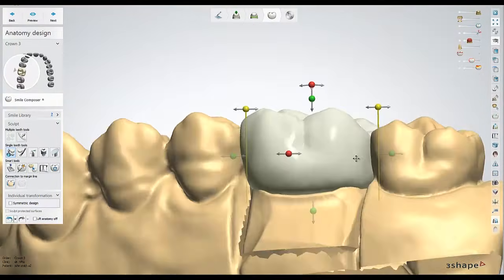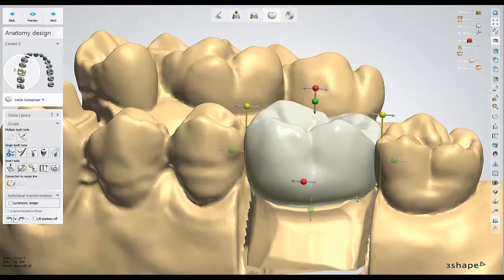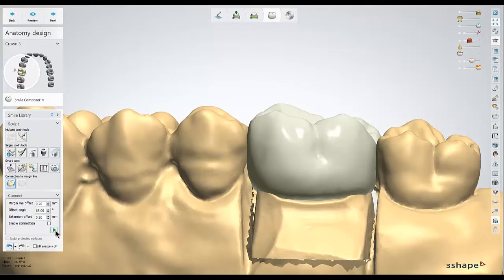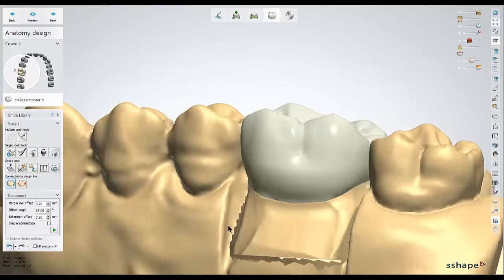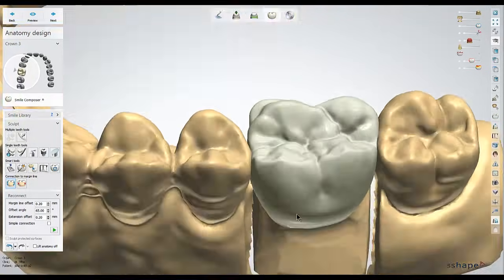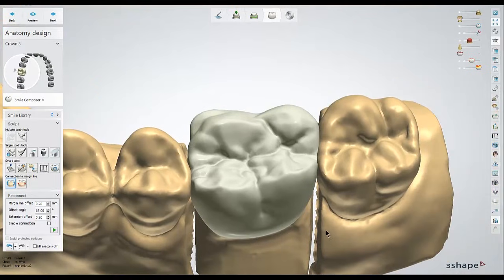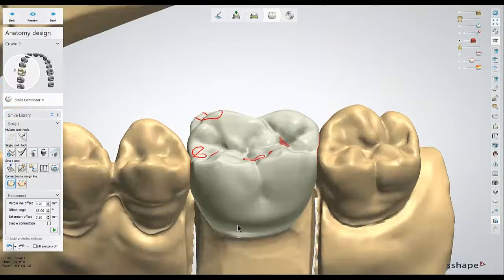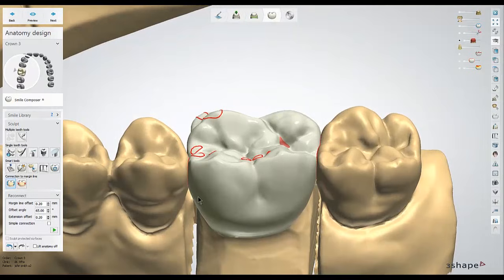Once it's mostly in position — it doesn't have to be perfect — I should be ready to reconnect this to the margin line. For that, I'll go to where it says connection to margin line and hit the play button. We should see it adapt the new crown position to the margin. Before moving on, I'm going to turn on some of the sliders on the top right: the red die or minimum thickness slider, so I'm aware of any thin spots, and the collision line slider, so I'm aware of where my contact points are.